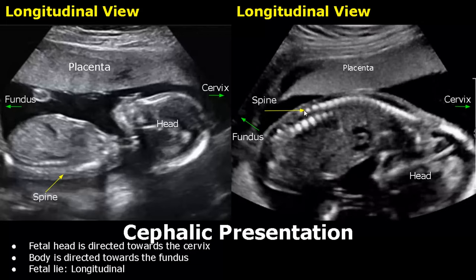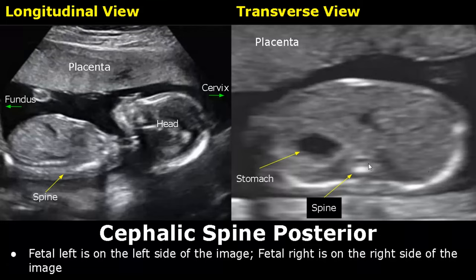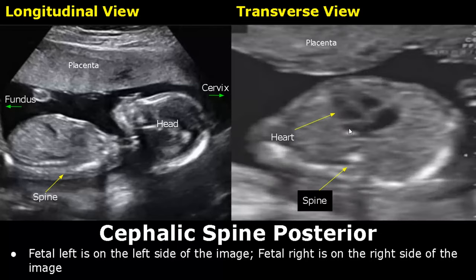This is a cephalic presentation with an anterior spine, where the spine is facing anteriorly. Regarding cephalic presentation, there are two orientations. The first one is cephalic spine posterior, where the spine is seen on the lower side of the image in both longitudinal and transverse views. In the transverse view, the fetal left is on the left side of the image and fetal right is on the right side. We can see the stomach on the left side of the image — so this is the fetal left. Similarly, the heart is also seen on the left side, with the apex pointing towards the left side of the image.